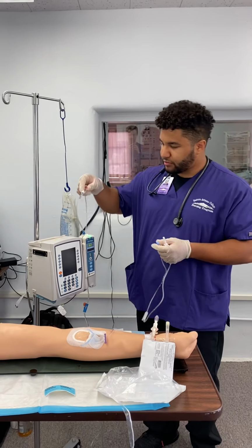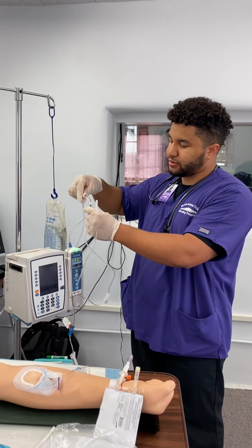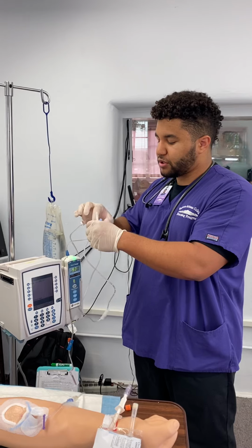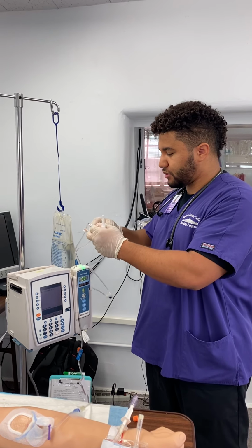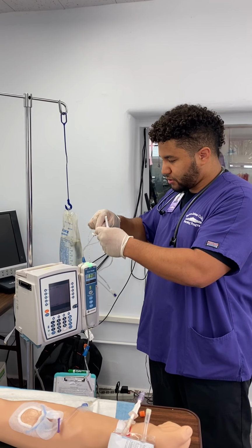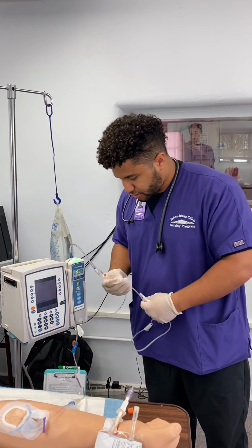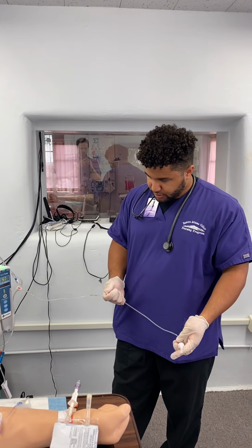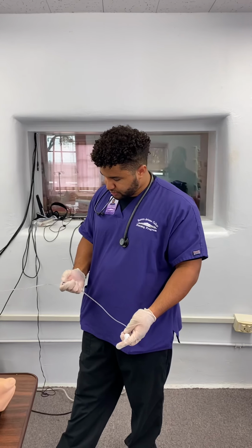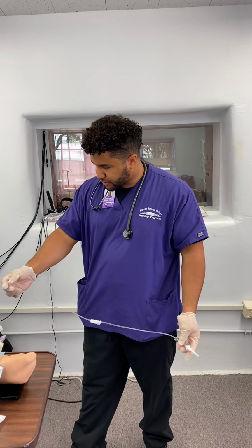For this, you're going to come above the chamber here to this wide port, and you are going to go ahead and connect your tubing, and you're going to go ahead and unclamp and allow this to fill up with water.